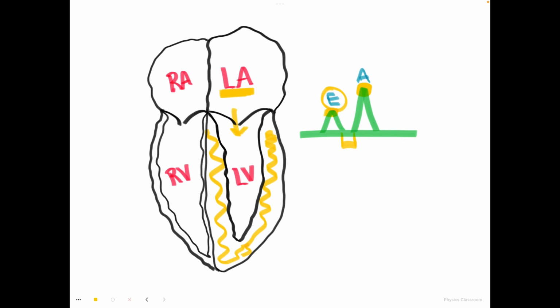So in your early stages of diastolic dysfunction, you're going to see an E to A ratio of less than or equal to 0.8. And that's because you have a low E divided by a higher A, it's going to equal less than 1. But 0.8 is usually what you're looking for when you're looking for diastolic dysfunction and looking at that diastology chart.